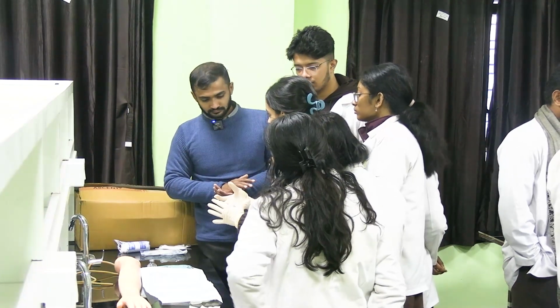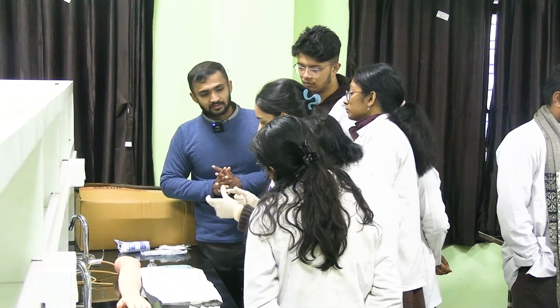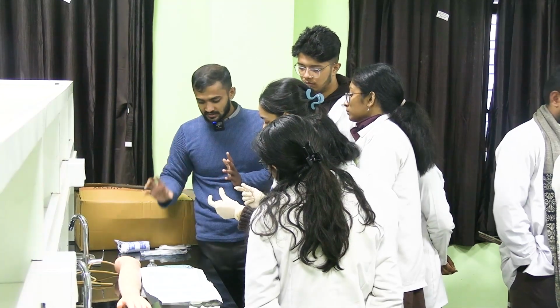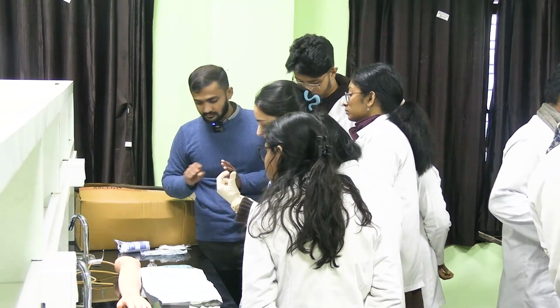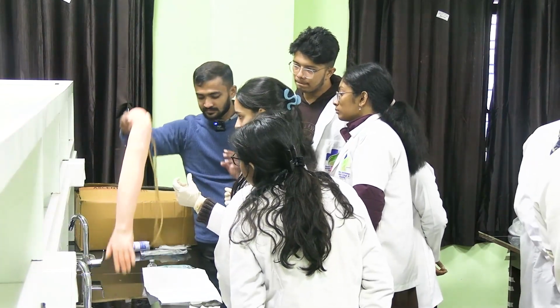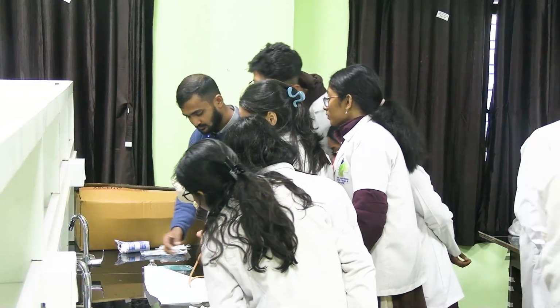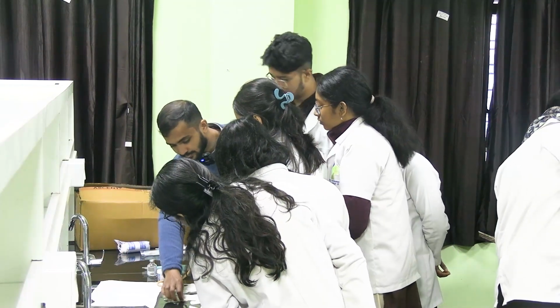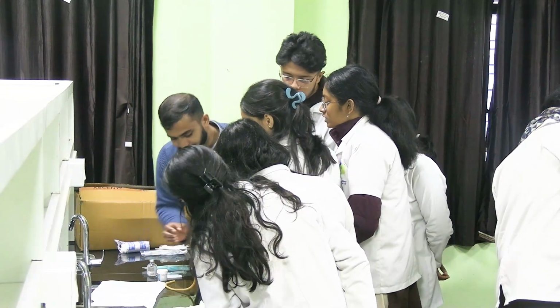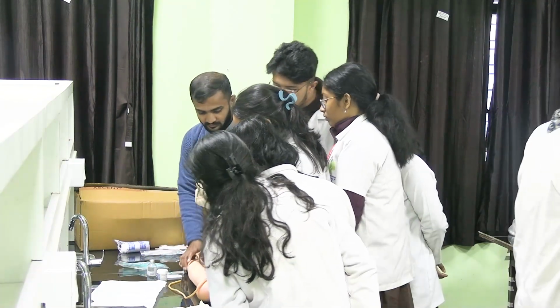I'll sanitize my hands. This is sterile. After that, I'll take the vial. You have to locate the site. Okay, locate the site of injection. Suppose for IM injection, which muscle will you be taking? Deltoid muscle. Which arm is this? This is left hand. Okay, left hand.